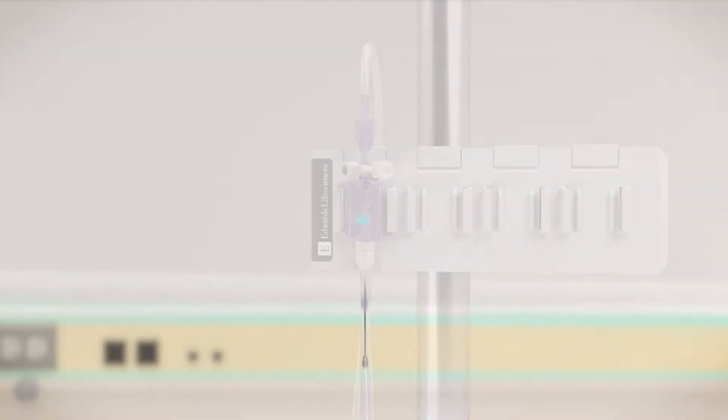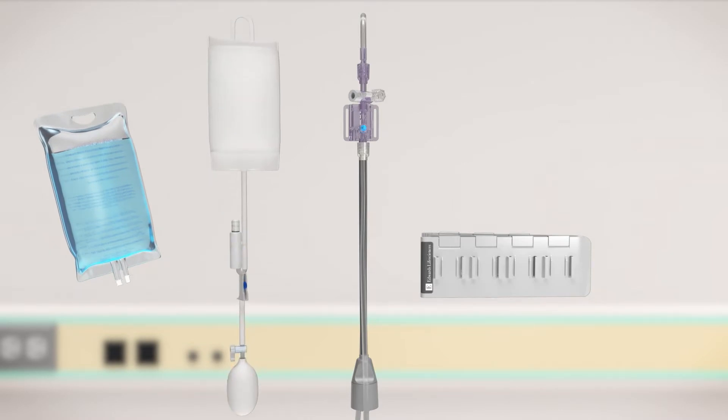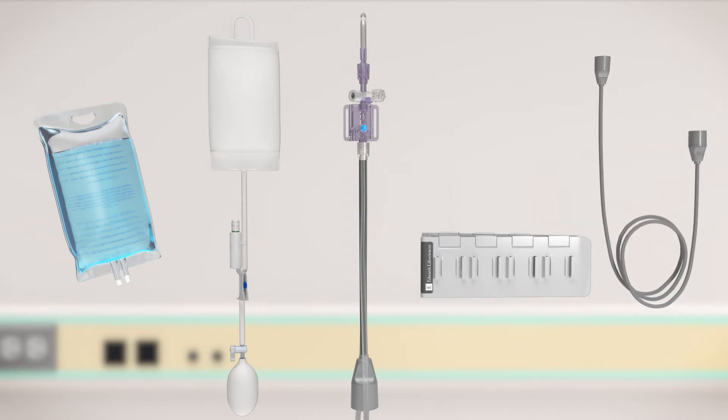Here's what you will need to get started: one TruClip holder or an arm mount strip, a 500 or 1000 milliliter normal saline IV bag, a properly sized IV bag pressure cuff, and an appropriate cable that connects your bedside patient monitor to the TruWave transducer.